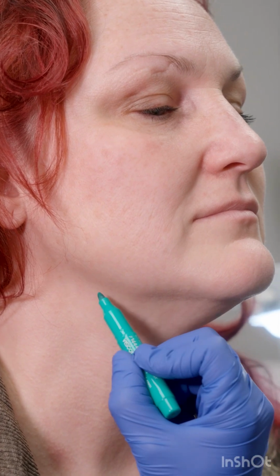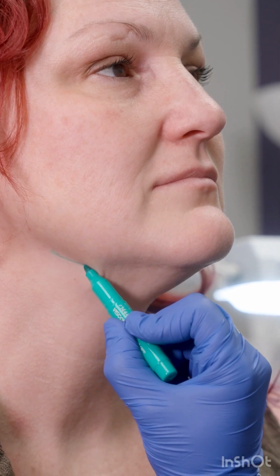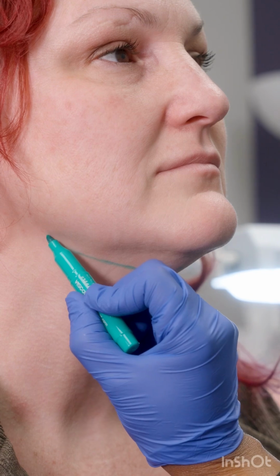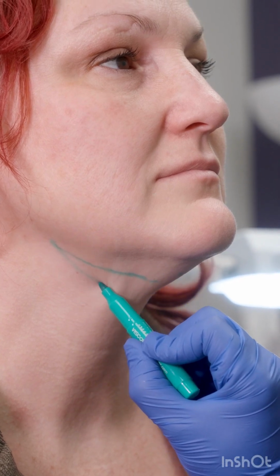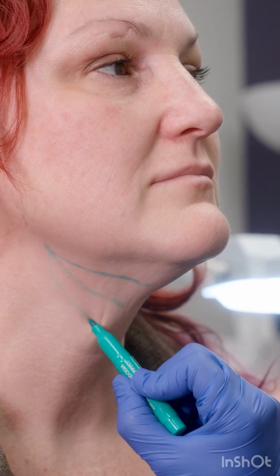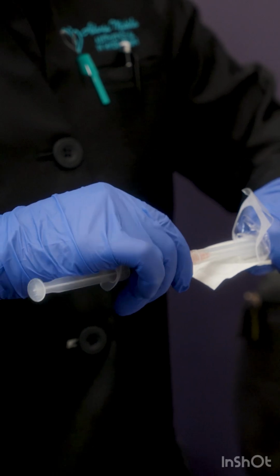By drawing the lines, I create the vectors that I will use in order to insert the PDO threads to create the lift that is ultimately desired. Typically, 3 threads on each side is enough to achieve maximal results, but more can be added if needed.